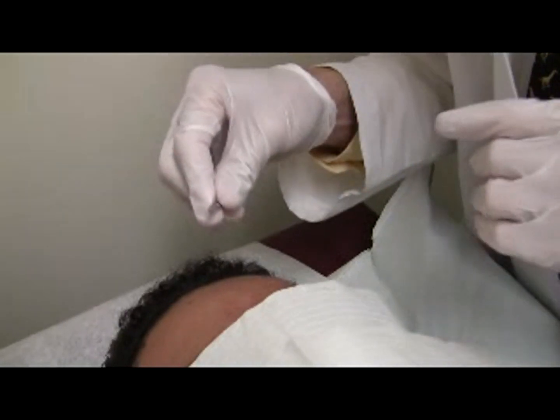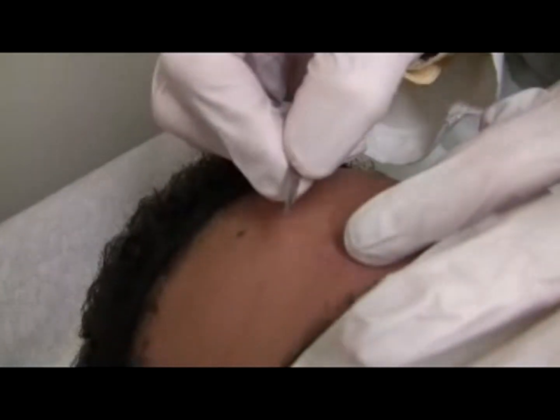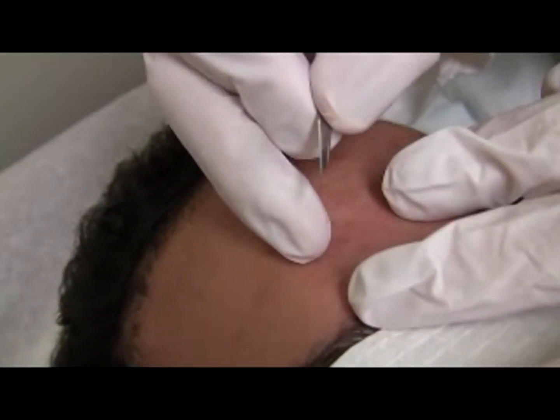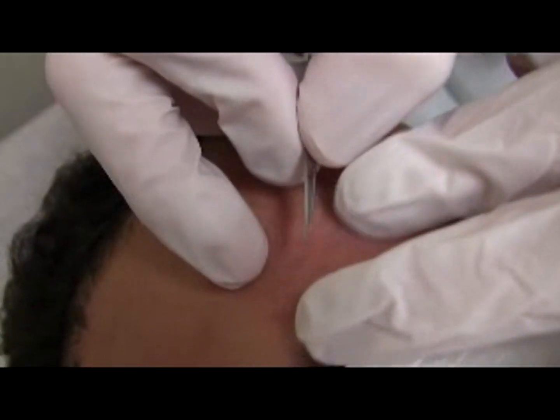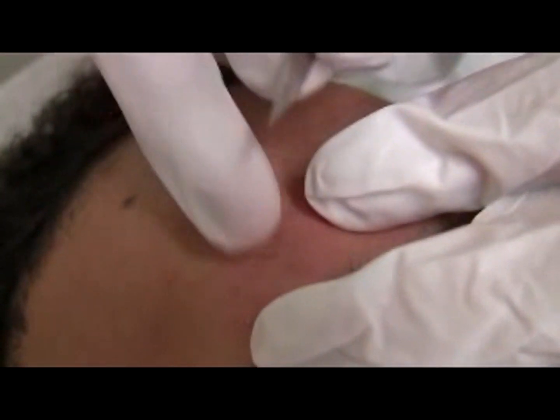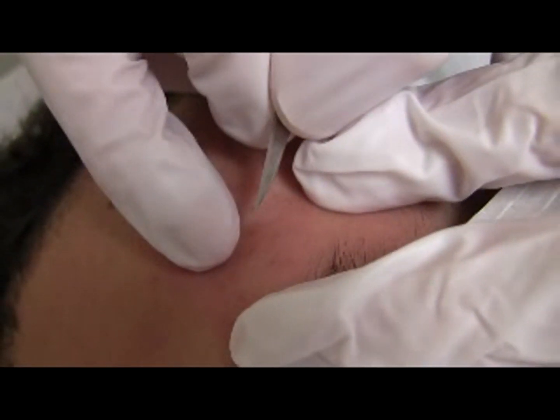Stabilize the target lesion with the left index finger. As a general principle for doing procedures, you want to always stretch the skin out and pull opposite to the direction of where the blade is going. I've now stabilized the lesion.